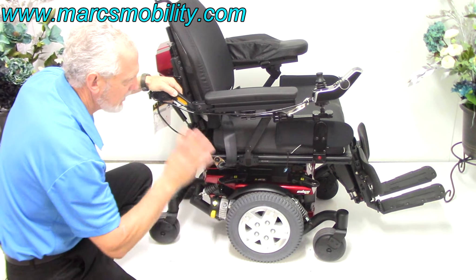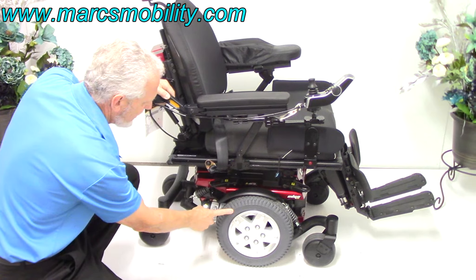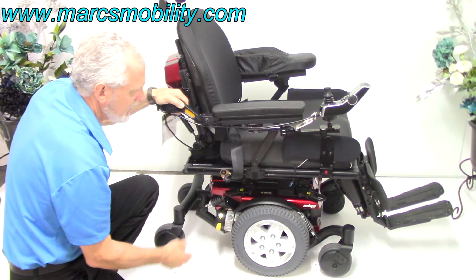You've got anchor points on each side — two on each side, four anchor points total. There's a heavy-duty motor with four brushes on this chair.